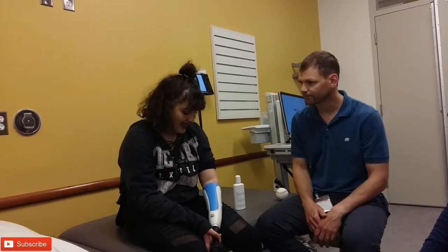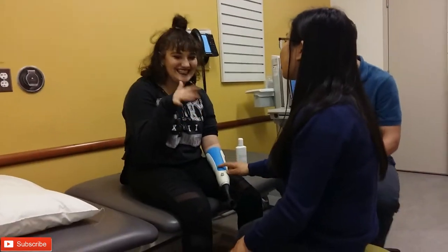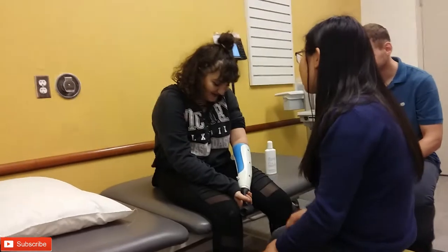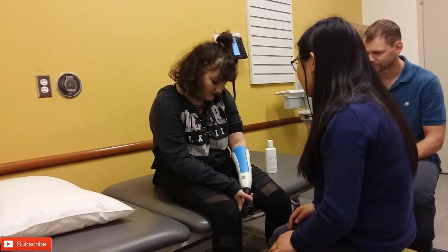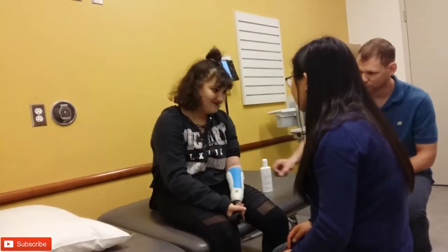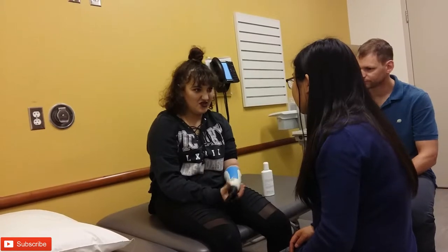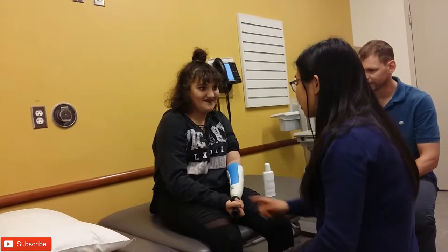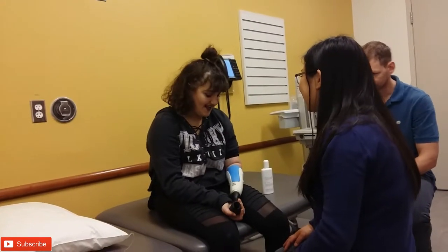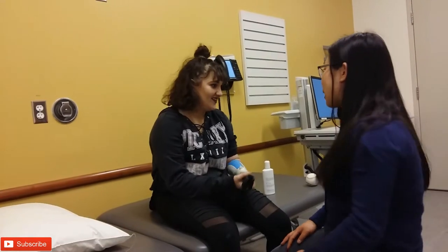So you mean like remake the casting and stuff like that? No, we won't do a casting — that stuff is so gross. We'll take the shape of this but redo the whole thing. I like it like this. We just wanted to show you. What do you think about the blue? It's pretty too. Do you like this white? We can do it a different color if you want. Black maybe, so it doesn't get dirty. That's a good idea — it'll match. Yeah, that'll be cool. You want to try that?